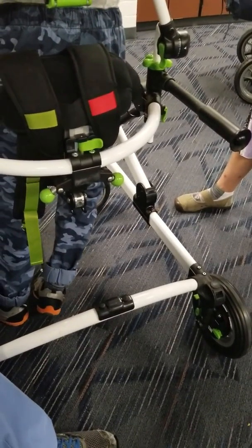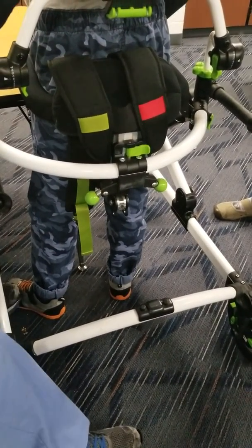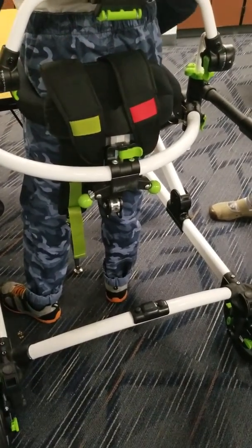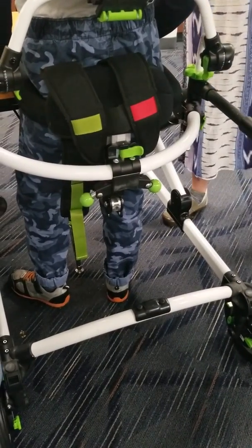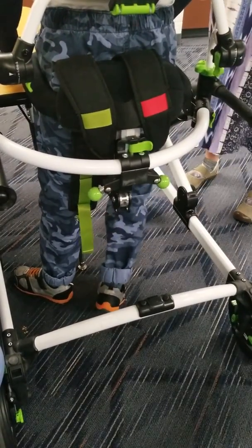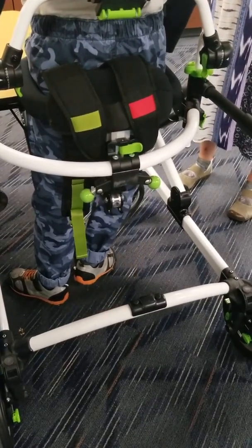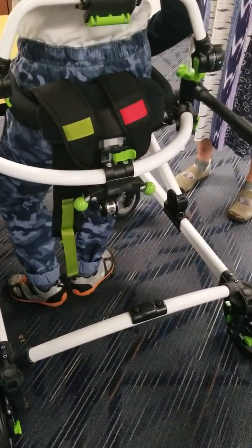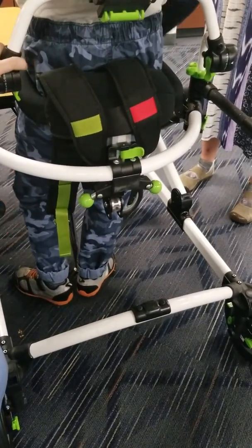Especially, and sometimes it helps because I think if he finds that seat, he'll use that seat. Exactly. So because we were using it, we generally will use it mostly when we're at a stop. Because I think it's kind of awkward to walk with, it gets in the way a little bit. So you can... Perfect job, awesome man.